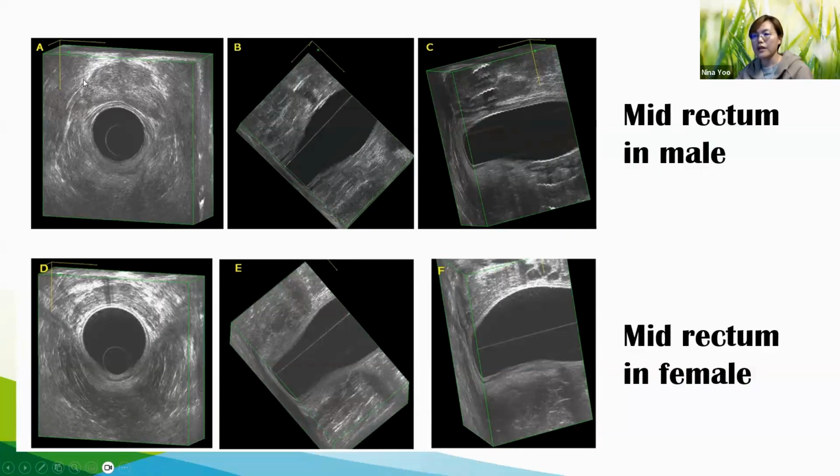But if the lymph node is located right next to the prostate, from 10 o'clock to 2 o'clock, where the pelvic plexus is located, if there's a lymph node metastasis, that's the key metastatic area. Probably that's the gateway of the nodal metastases to the lateral pelvic side wall. If there's a node around this area, you can see it. But the obturator node or internal iliac node, those you can't.